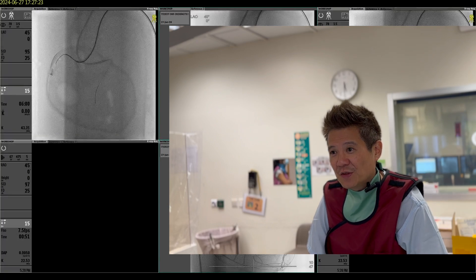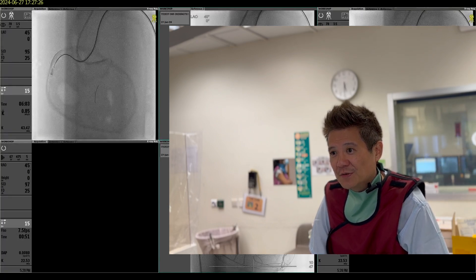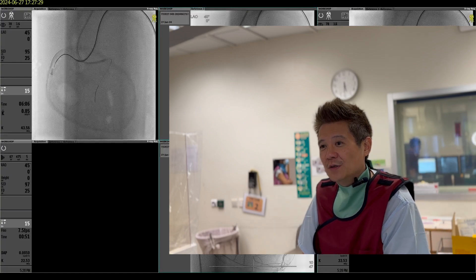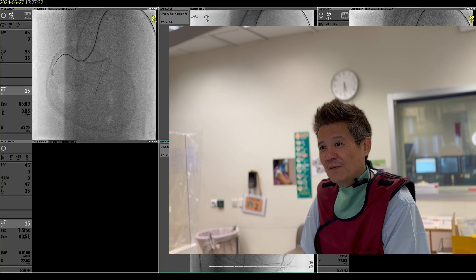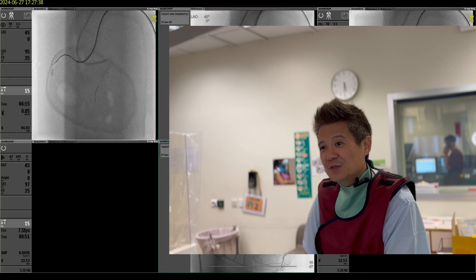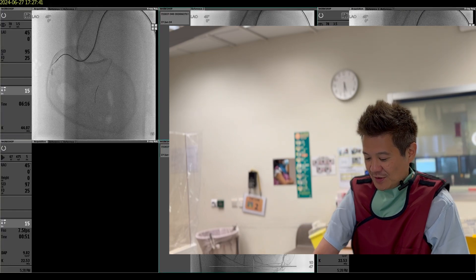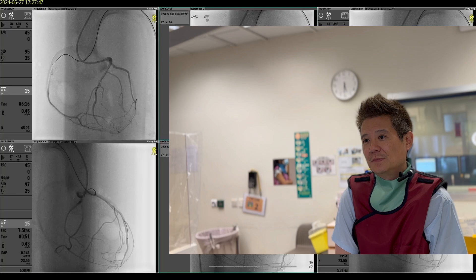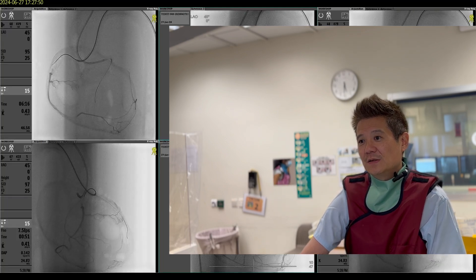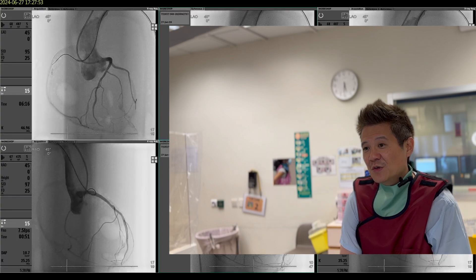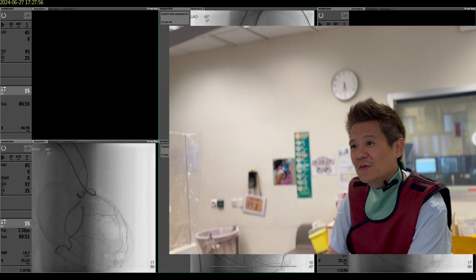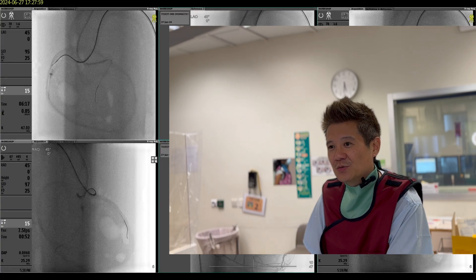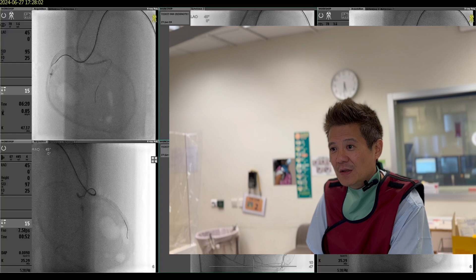I'm going to get more support because we need microcatheter support. I'm going to rotate the wire in the LAO towards the target. The wire flipped out a lot — this sometimes happens, especially since we knuckled. So now we're in a new position and we need another shot to determine the place. The RAO is now the near view; the LAO is the far view. On the LAO we want to rotate the wire towards the target.